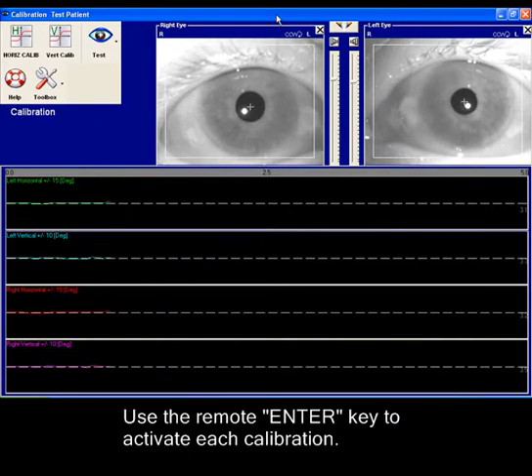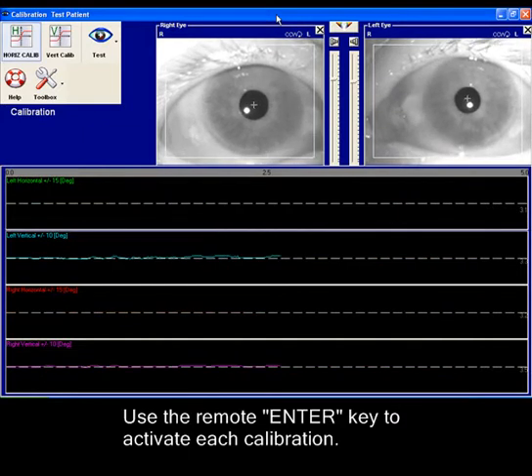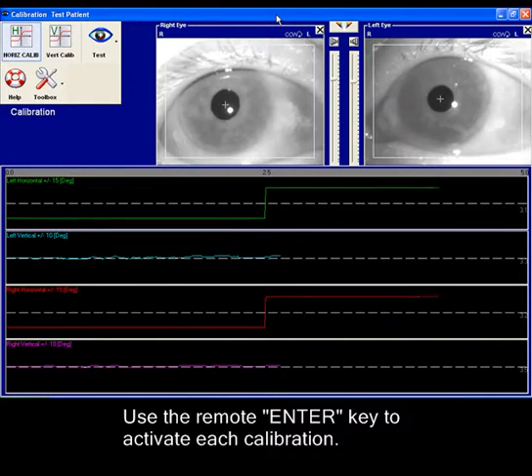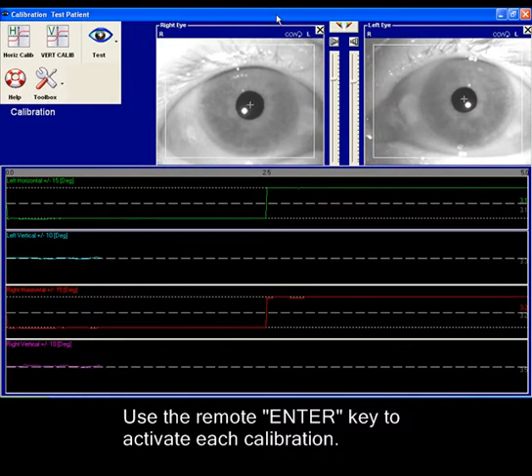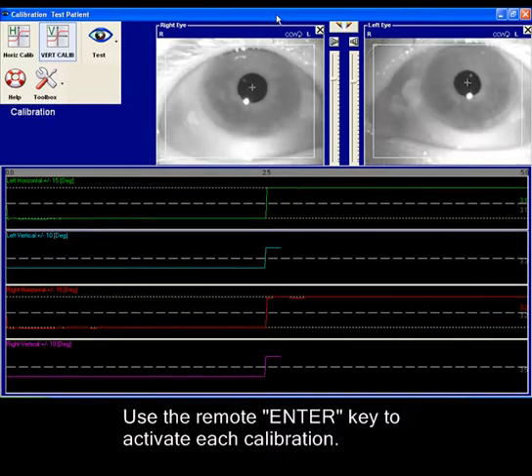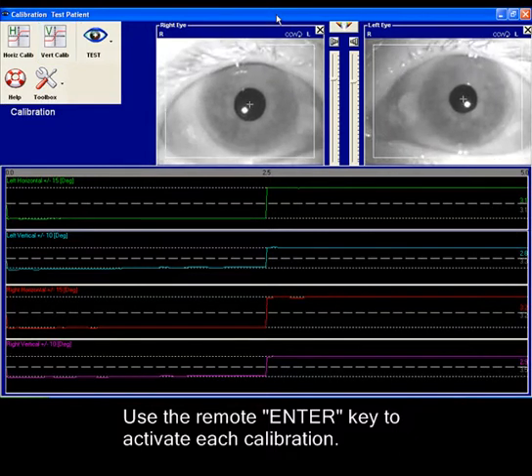We will start off with horizontal calibration. The patient will look left, right, and center. And then for vertical calibration, the patient will see the target going down, up, and center.